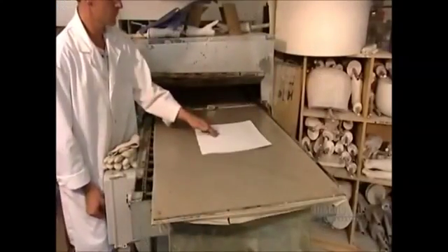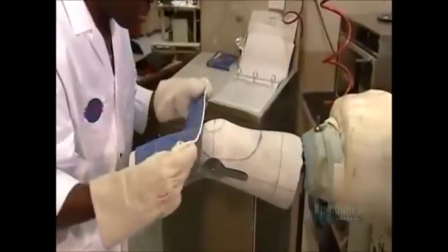Now they run a sheet of plastic through an oven. This is high-memory plastic, meaning that when you form it, it remembers the shape and maintains it. The design the patient chose comes printed on transfer paper. They use a laser thermometer to ensure the plastic is at the perfect temperature for the pigments to penetrate properly.